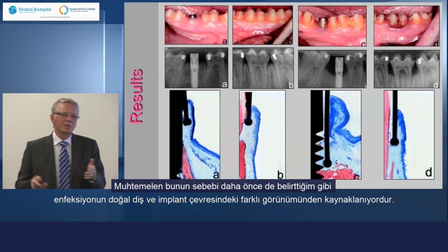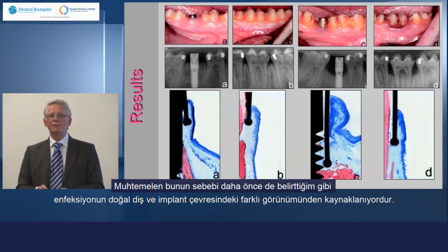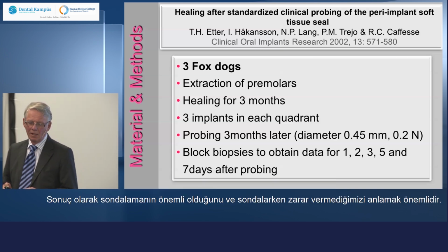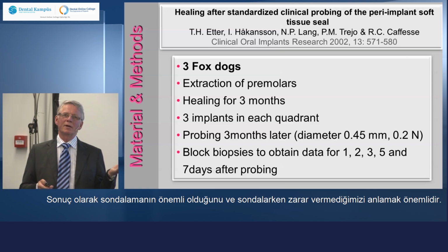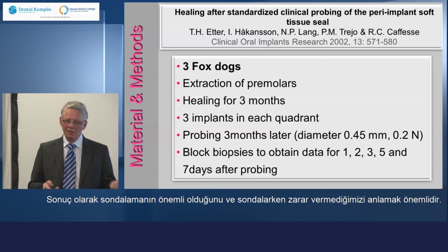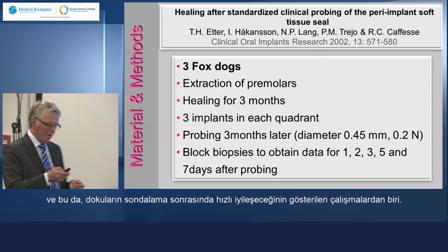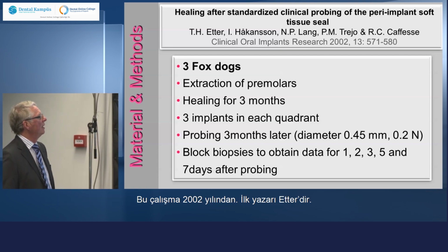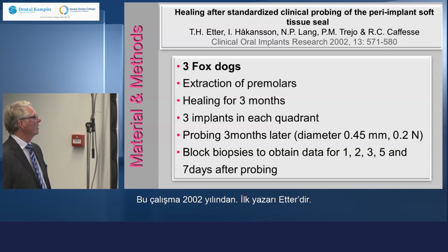Probably, as we discussed before, this is dependent on the infection looking different around implants than it does around teeth. So it is important, of course, to understand that it is possible to probe, that we do not damage the tissues. And here is one of the studies that has shown that it will heal quite soon after probing. It's a study from 2002 with Etter as first author.